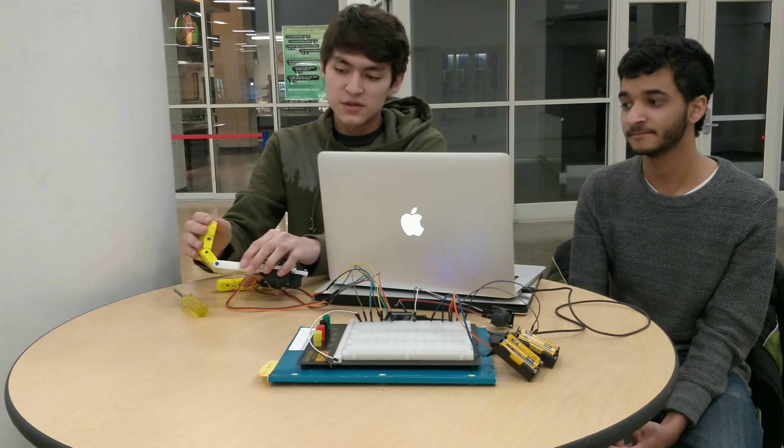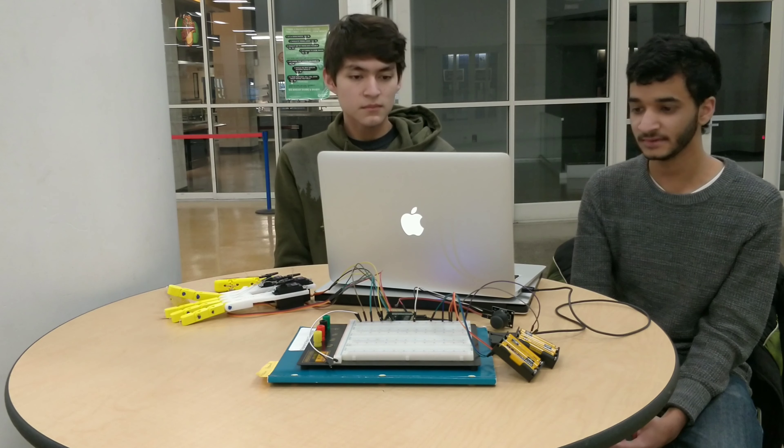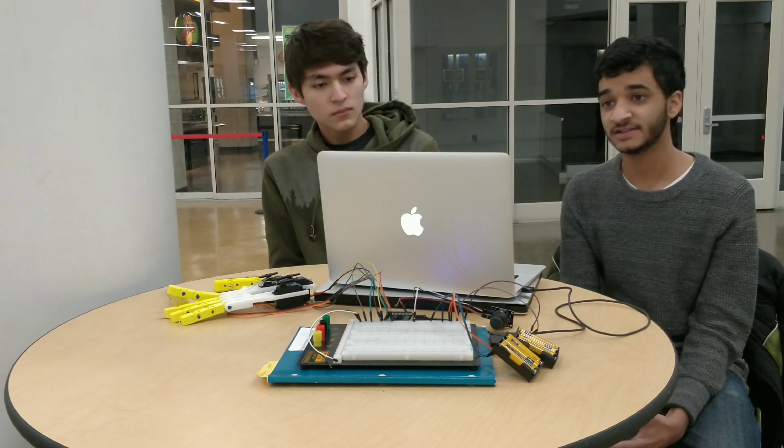25,000 people per year lose a hand in the U.S. Many of these people are working class and cannot afford to spend tens of thousands of dollars on a bionic hand. As a result, the market is worth $300 million.